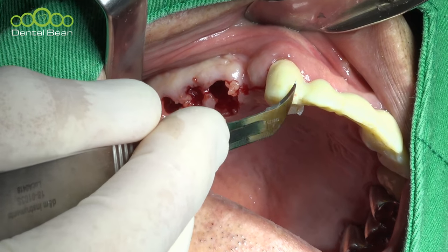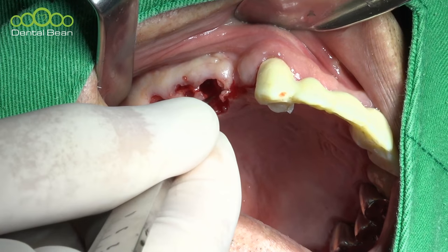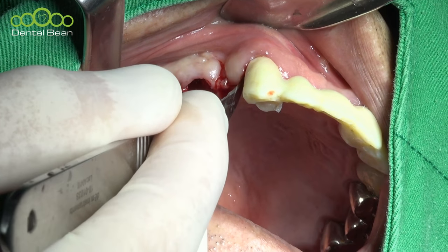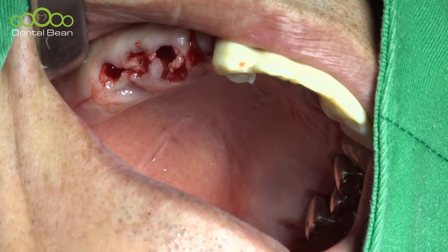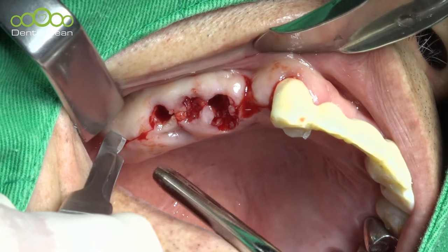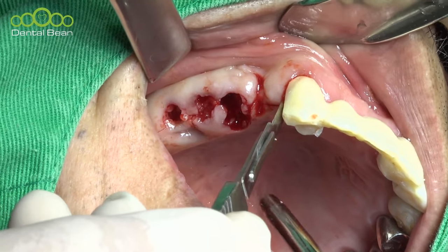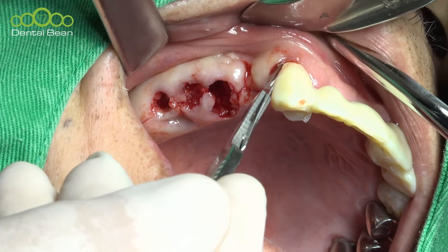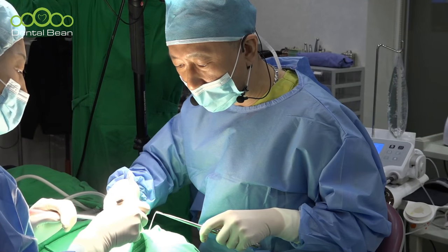Actually, this anterior bridge is from the CT scan and just a 3D printer. I already made it, and I delivered it as the temporary setting. Usually, for an easy flap elevation, wide cutting in the distal area is good. Like here. And then the sulcular incision, and then a vertical incision from the midpoint of the adjacent tooth.